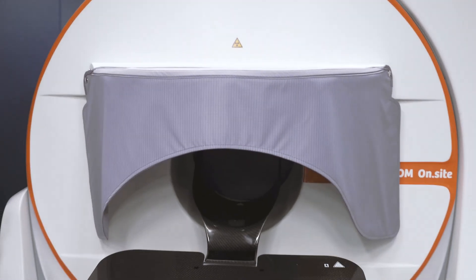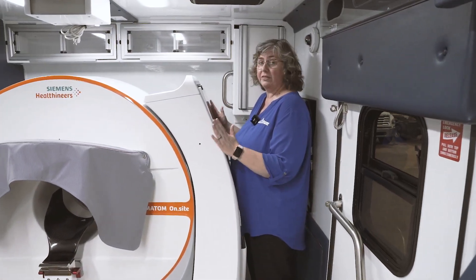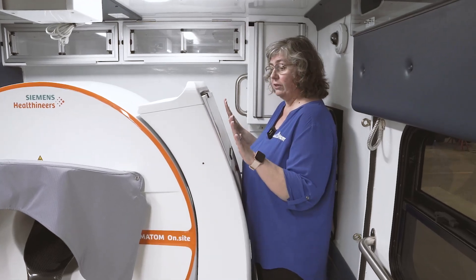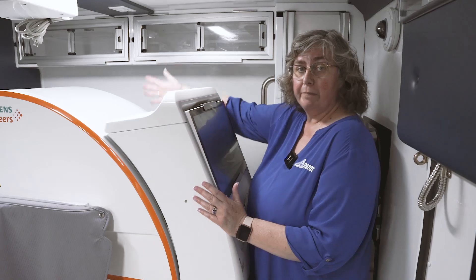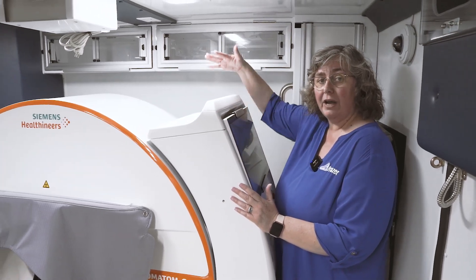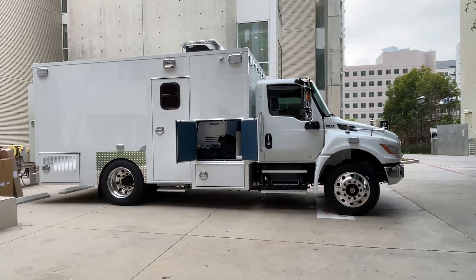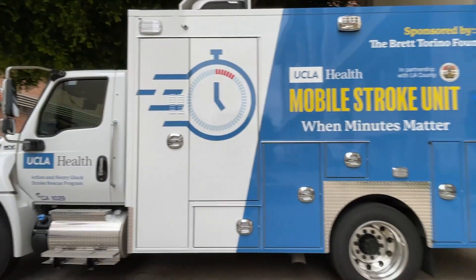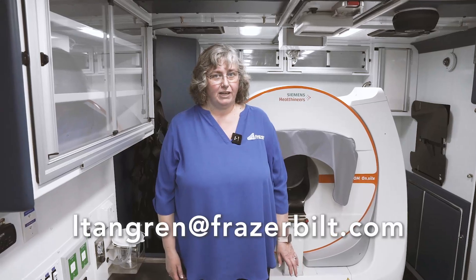The best part is your provider gets to stand right here to run the scan. They can see everything that's going on, and they're protected from the radiation because the back is lead-lined, the gantry is lead-lined, and there is a lead curtain to protect them. If your community is interested in starting a mobile stroke unit program, please reach out to me at ltangren@frazerbilt.com.